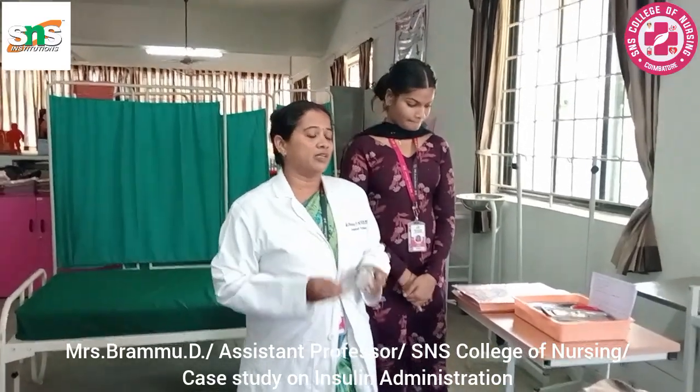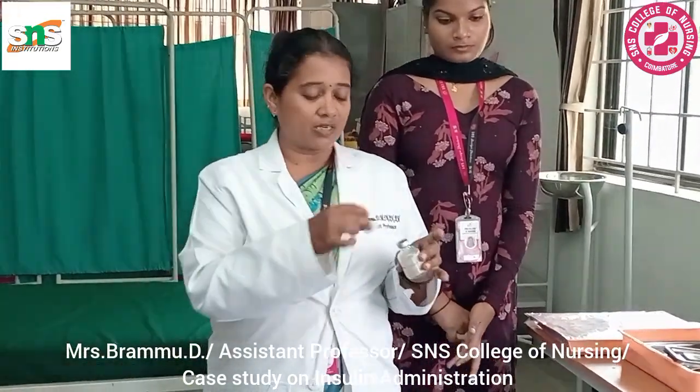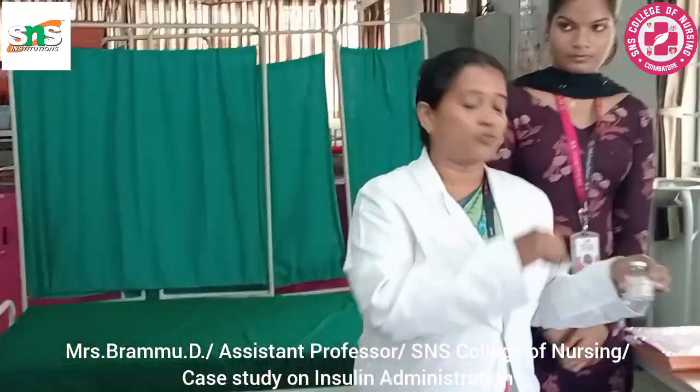So if it is a multi-dose vial, it will be dated with the date of opening, as we have dated over here. And before you take the medicine, always do the decontamination using circular techniques onto the cork. This is nothing but removing the microorganisms which have settled over the cork region. Right? Now, are you clear why we do this procedure?